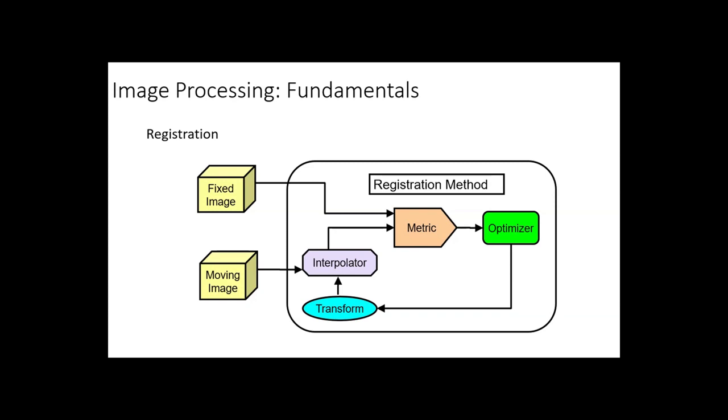Like this is 5 fingers, and I have another 5 fingers, right? We want to warp, find the deformations to align them so it looks like one hand. So this is a component in the image registration black box. The output is the transformation, which we often call the deformation field. It's a deformation for each point here, and then we just warp. This allows us to warp this moving image and make it look similar to the fixed image.